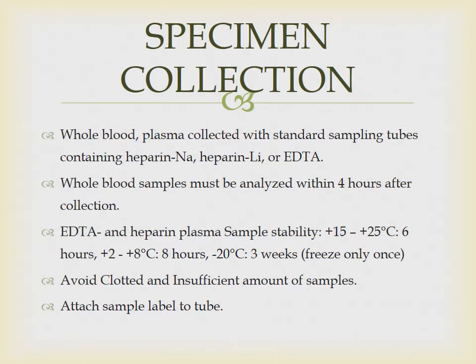In specimen collection, whole blood or plasma is collected with standard sampling tubes containing heparin or EDTA. Whole blood samples must be analyzed within 4 hours after collection. EDTA and heparin plasma sample stability: +15 to +25 degrees Celsius is 6 hours.